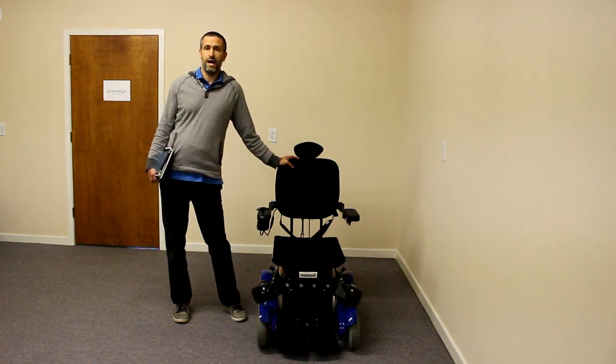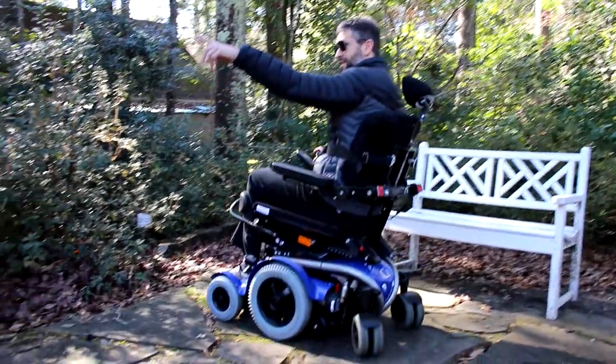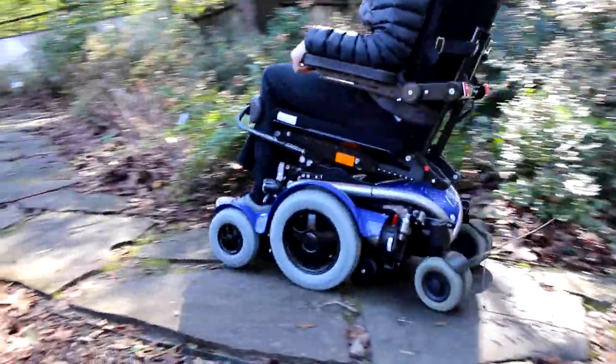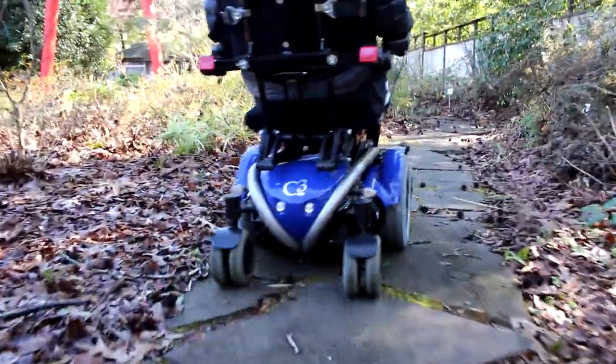It also handles outdoor terrain really well. With the four powered wheels and the dual drive, you can get through rougher terrain a lot easier. You can get over four-inch curbs with ease, so it's definitely nice for someone who is active.